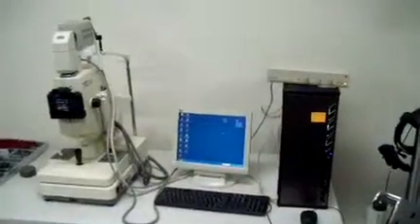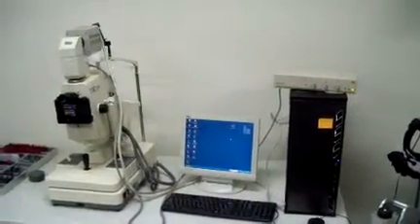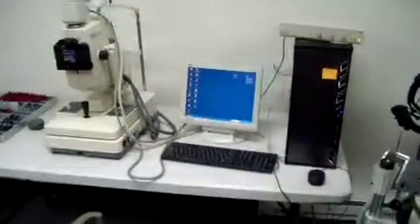This is DCSP Medical. We're looking at a Topcon TRC50IA camera. It comes with the Kodak camera module.